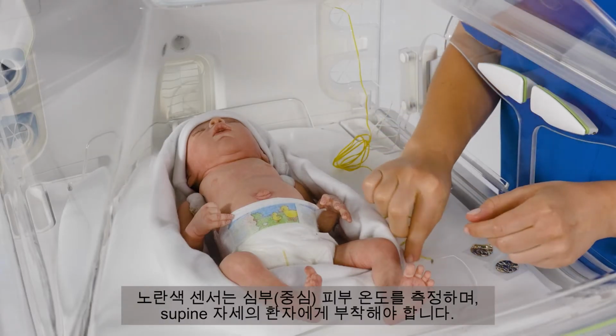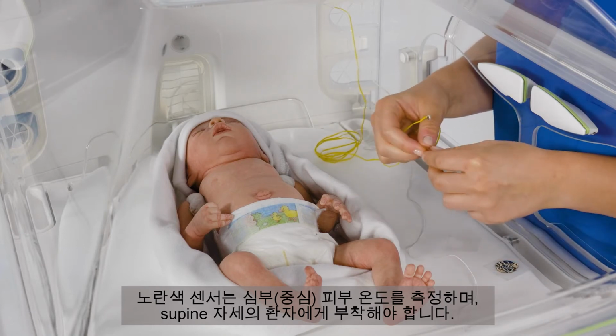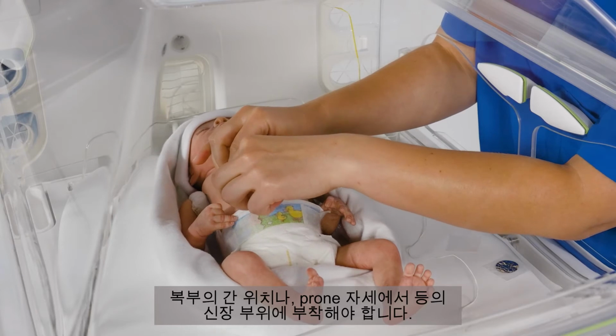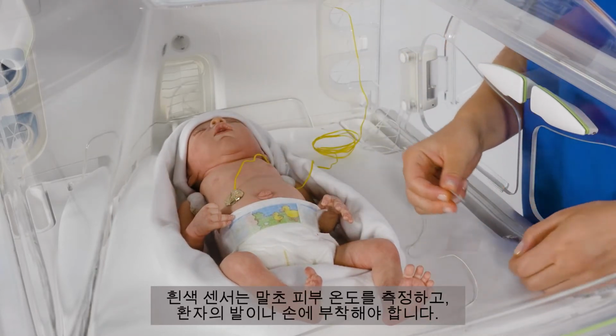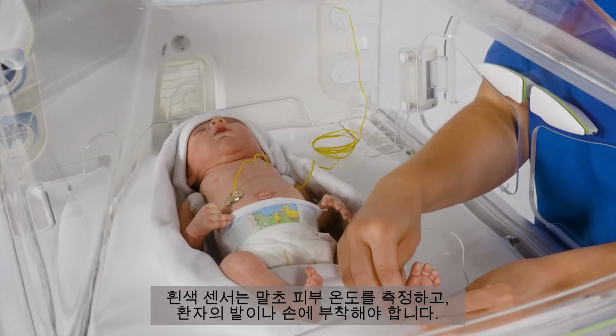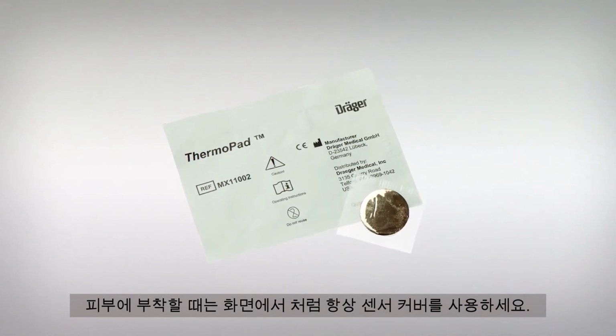The yellow sensor measures the central skin temperature and should be attached to the patient at either the supine position on the abdomen in the liver region or prone position on the back in the kidney region. The white sensor is for measuring the peripheral skin temperature and should be attached to the patient's foot or hand. Please always use sensor covers as shown to attach sensors to the skin.